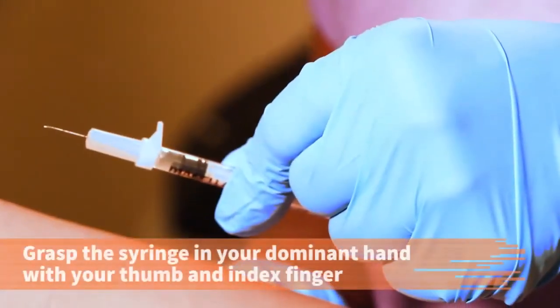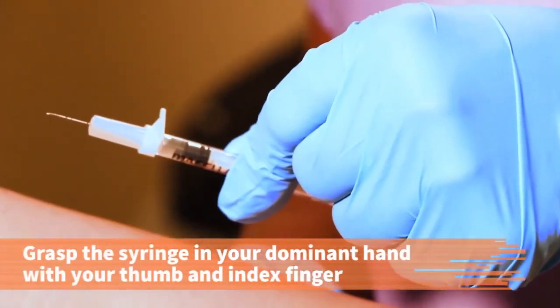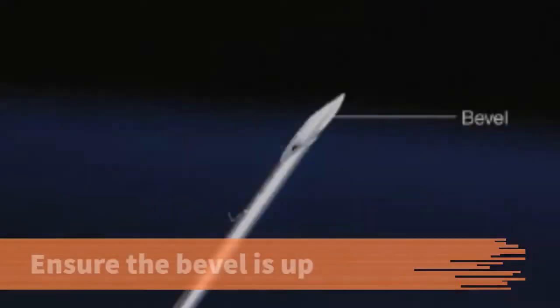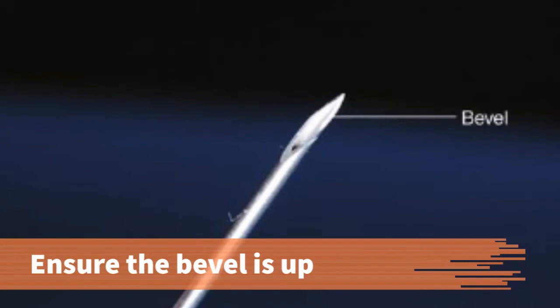Grasp the syringe in your dominant hand. Use your thumb and index finger. Make sure to have no fingers under the syringe. Ensure the bevel is up.